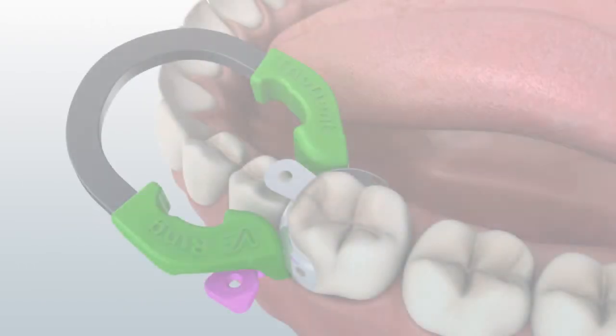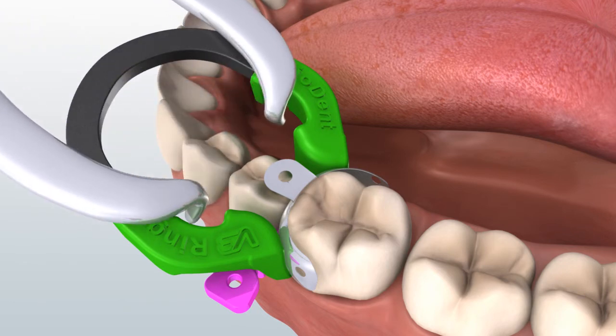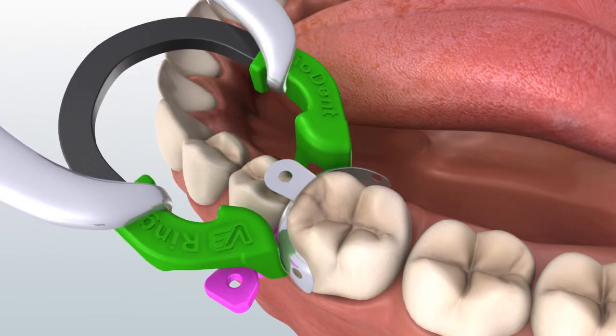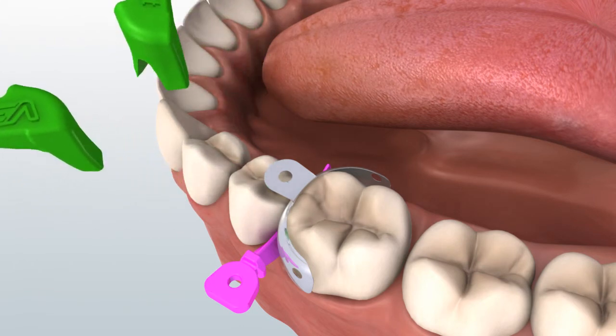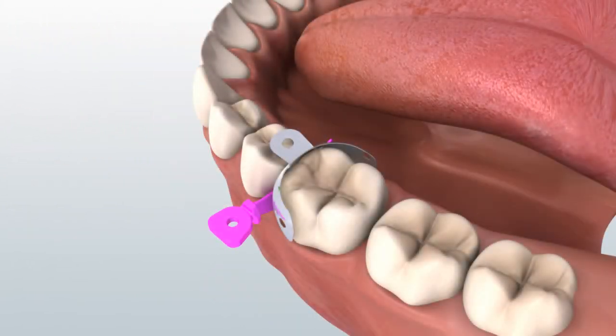Continue with the restoration until the final increment of composite has been placed and light cured. Remove the V3 ring with the forceps. Peel the matrix away from the composite using a probe. Additional light curing from buccal and lingual aspects is a good idea to ensure that the composite is fully cured.